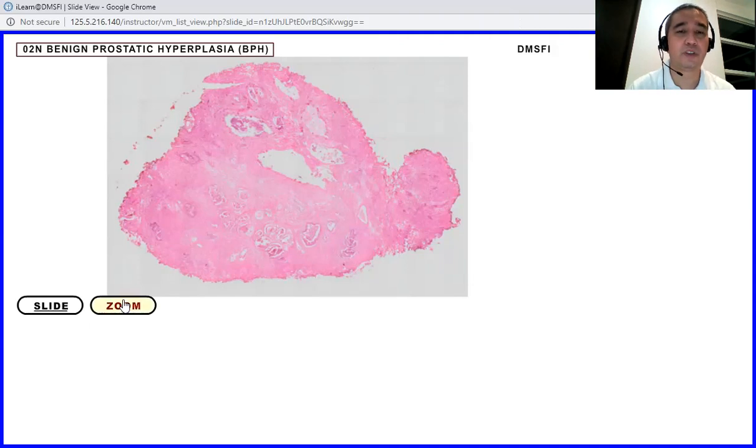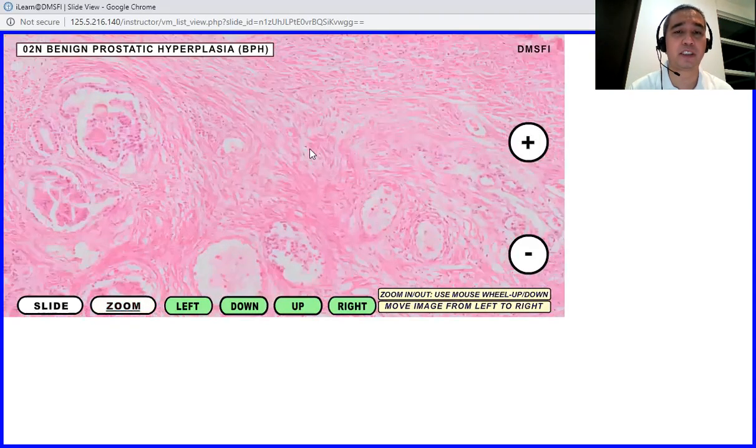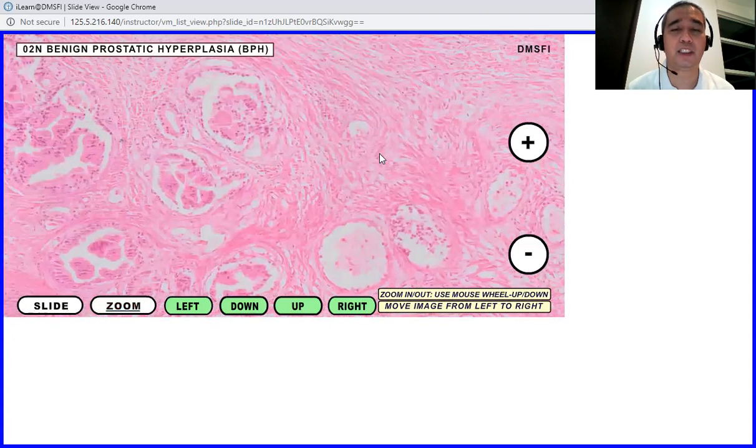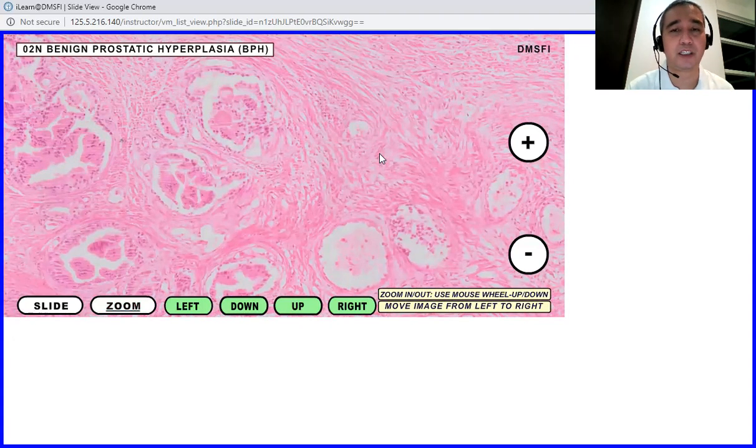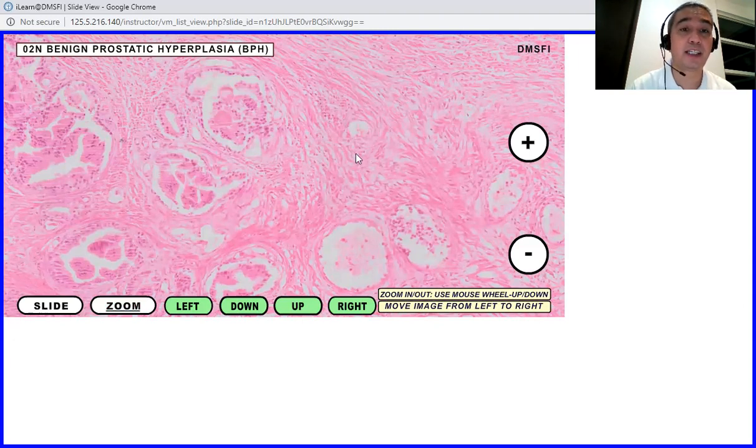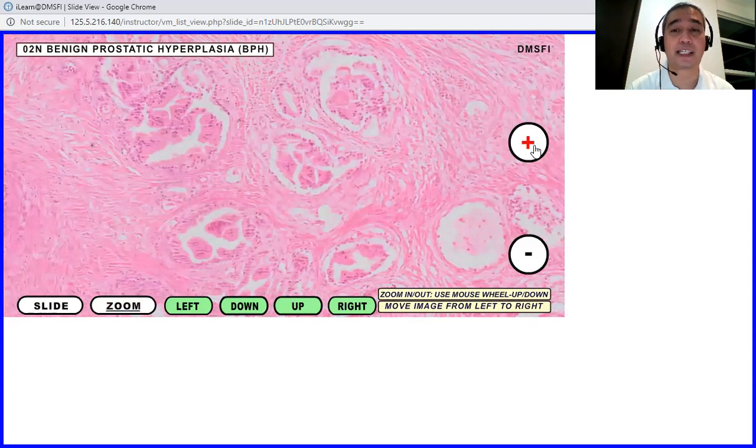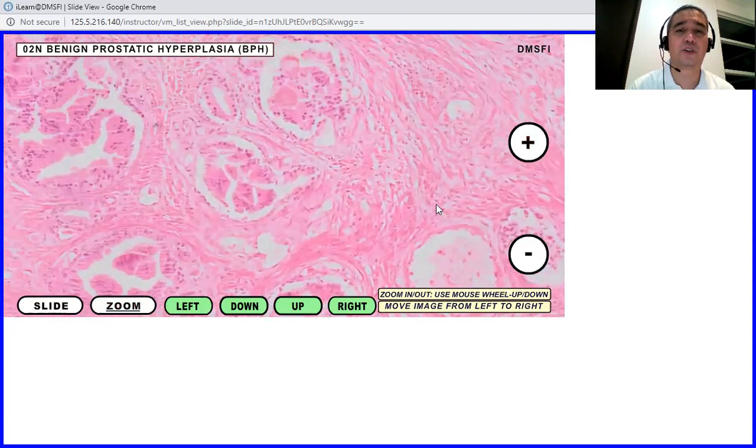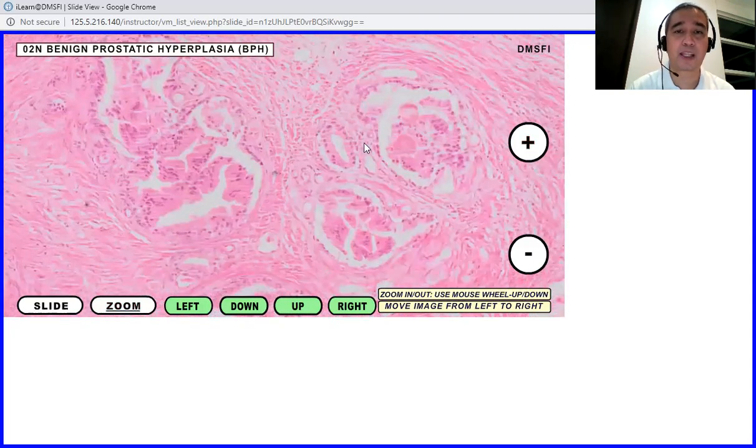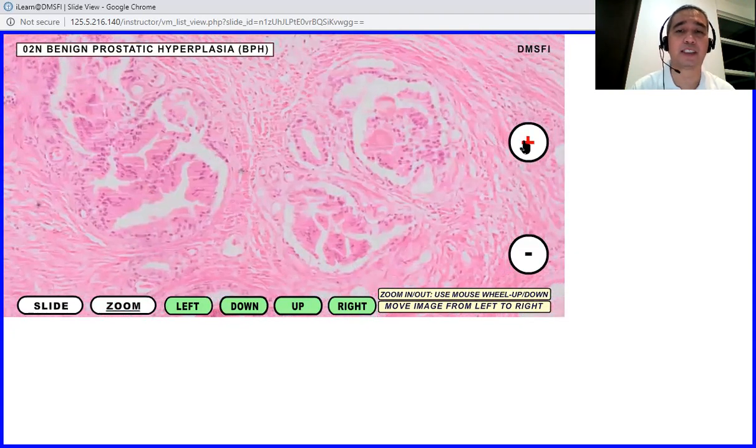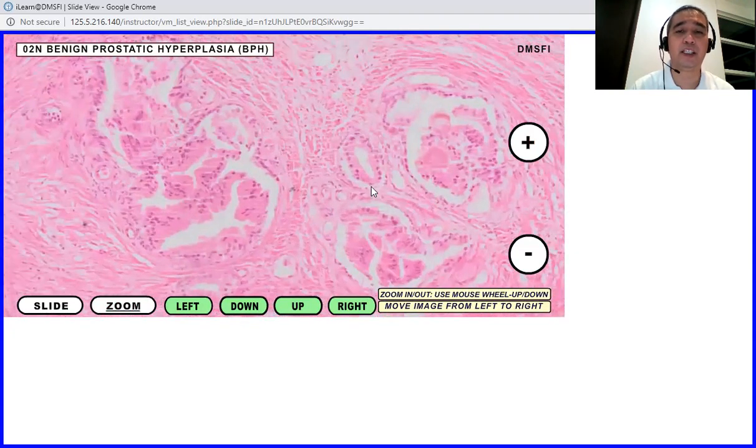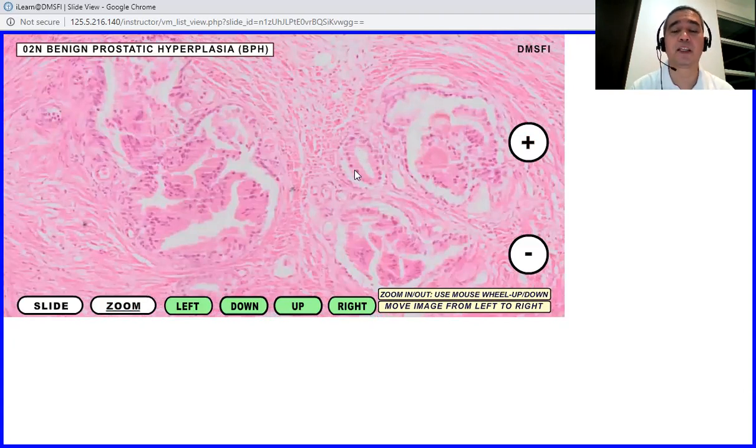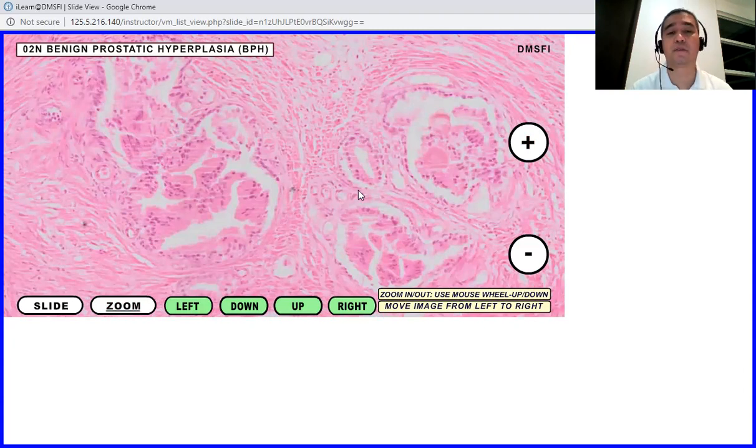So we zoom in on the slide. You remember the different parts of the prostate? Okay, so we have the stroma, which is fibromuscular. And then we have the glands or the acinar structures. So in normal conditions, this would be the appearance of the prostatic acinus, wherein they appear to be tubular and they are lined by single layer of simple columnar cells.